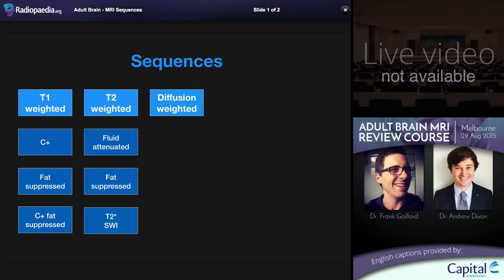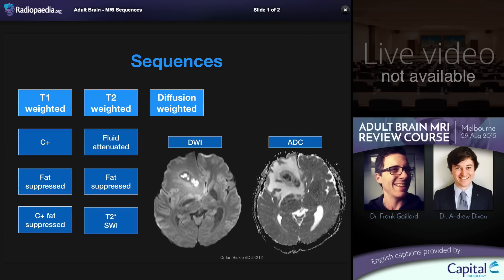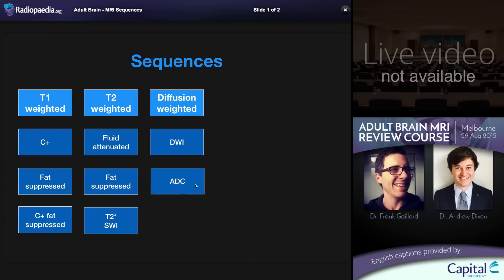The next column is diffusion weighted imaging, which really encompasses two main sequences: what we commonly refer to as DWI — diffusion weighted imaging or isotropic imaging — and ADC, or apparent diffusion coefficient. The DWI sequence is a relatively dirty sequence made up of both true diffusion information and T2 information. Examining DWI on its own can lead you to erroneously interpret high signal as representing true abnormal restricted diffusion when in fact what you're seeing is so-called T2 shine-through. I will be creating a separate talk to examine DWI more thoroughly, as it's a very important and often misunderstood sequence.